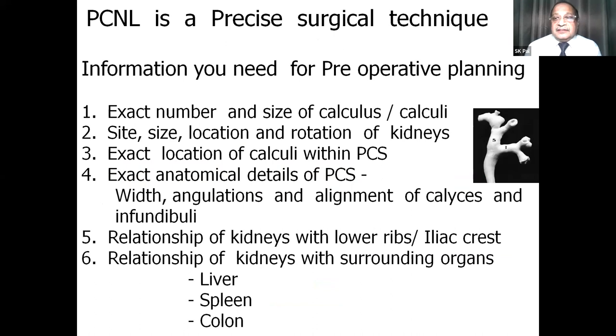See, PCNL is a precise surgical technique, and therefore, before we undertake PCNL, we have to have precise information as to what is happening, where we are going, and where we are going to strike. So we should know the exact number and size of calculi in the pelvicalyceal system. We should know the site, size, location, and rotation of the kidneys. We should have the exact location of calculi within the pelvicalyceal system. Exact anatomical details of the pelvicalyceal system, like the width, angulations, and alignment of calyces and infundibuli. We should also know the surrounding areas from where we are going to take entry into the kidneys, that is the lower ribs and iliac crest. We should know the adjoining organs, where they are and how much they can come in the way. So all these things should be known by preoperative imaging to be hitting it precisely.